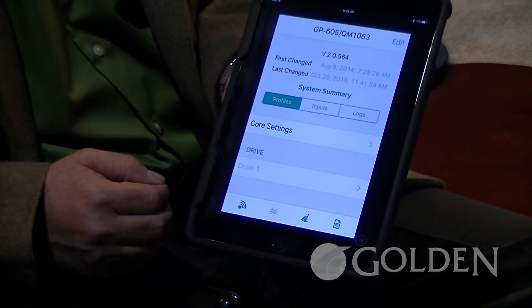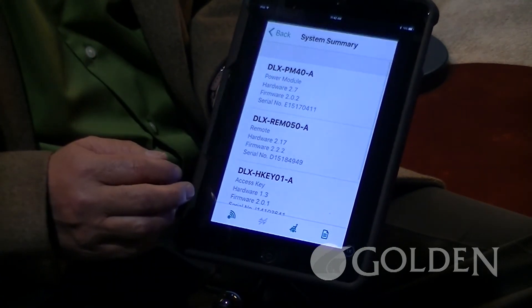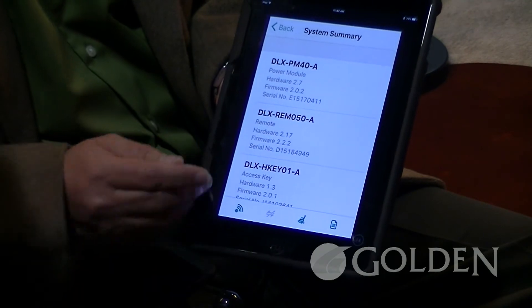Another really nice feature, which always seems to be a problem, is finding the serial numbers on these major components. We'll go to system summary, and that will show you your power module serial number, the remote serial number, as well as the access key serial number — all right there at your disposal.